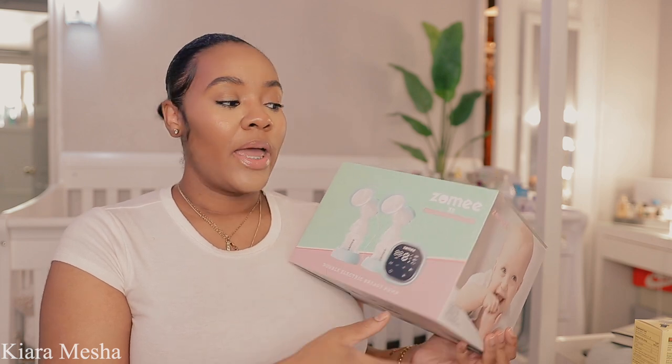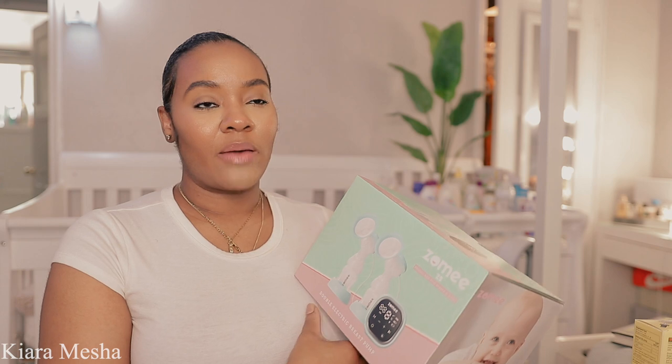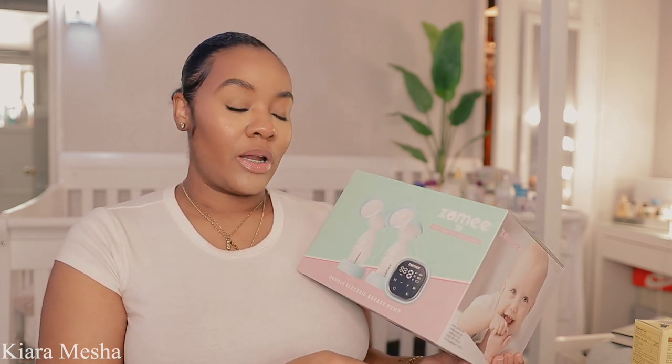My baby sister actually has this same exact breast pump and I was like, 'hey what type of breast pump do you have?' She was like, 'oh I have this portable one,' and she showed it to me, and I was like wow, that's great.